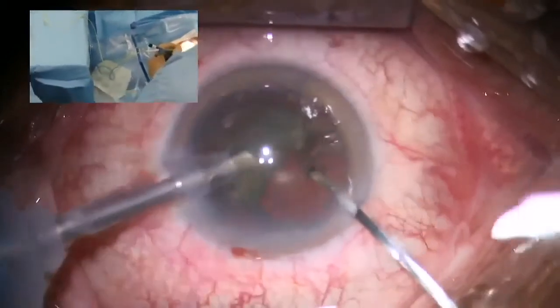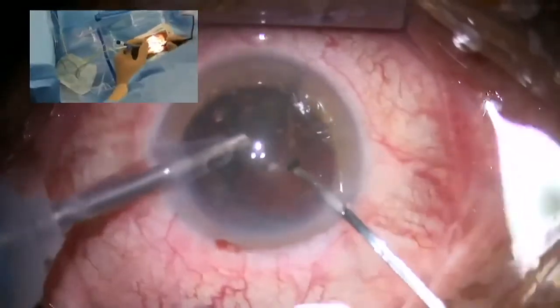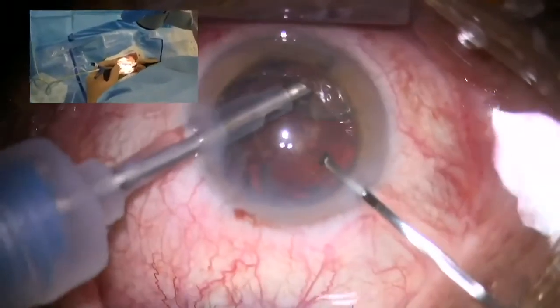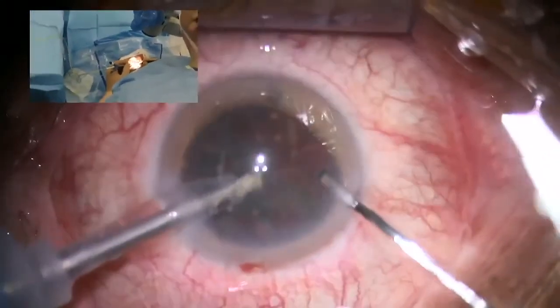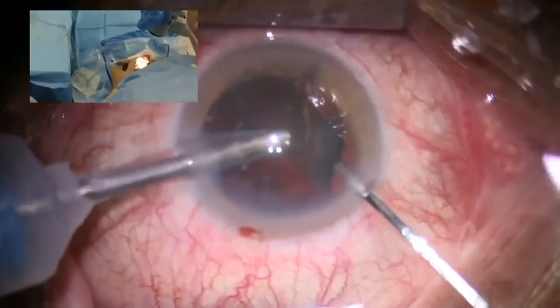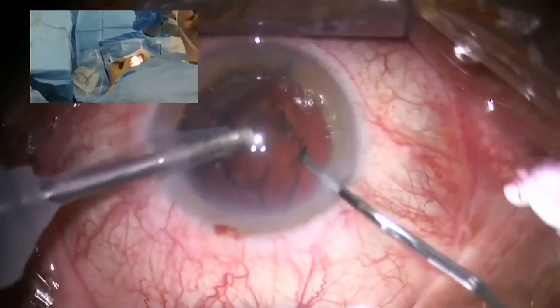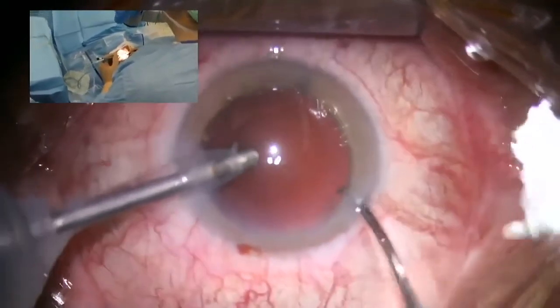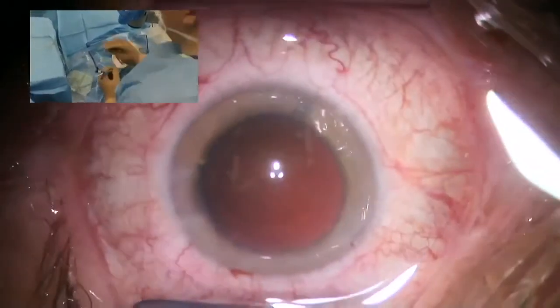Rotating the angulated opening hole of the nanolaser to reach the left parts of the lens inside the capsular bag. Here we go.